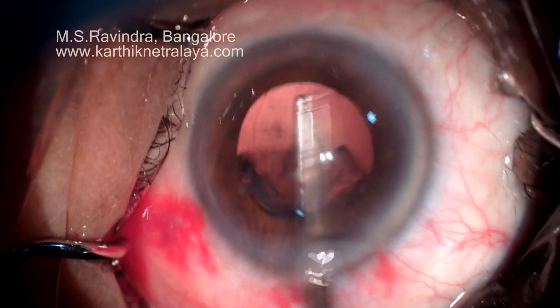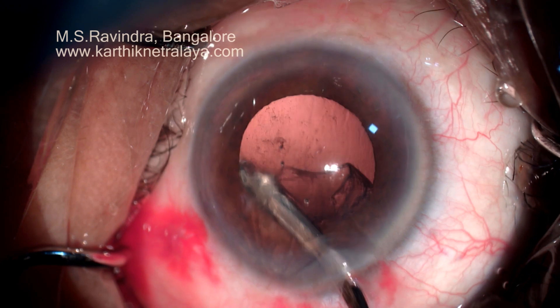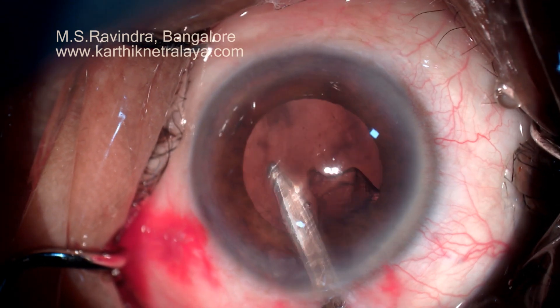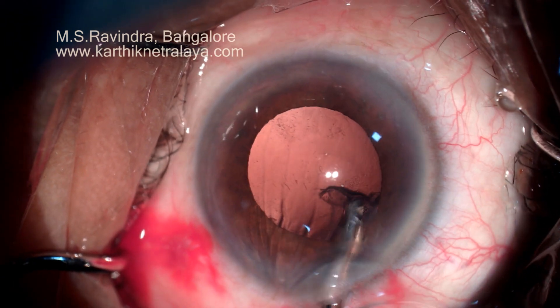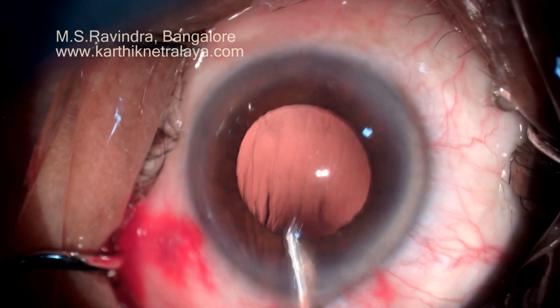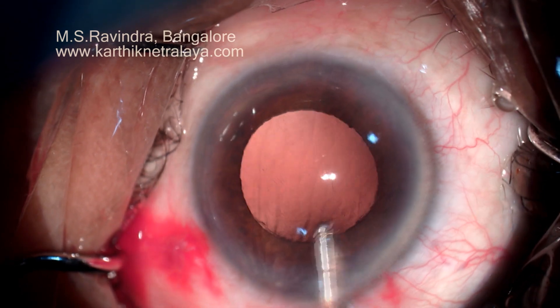The pressure throughout the technique is low — it's atmospheric, or at the highest it is the normal intraocular pressure. The anterior chamber is not ballooned backwards. There is no stress on the posterior capsule and the zonules.